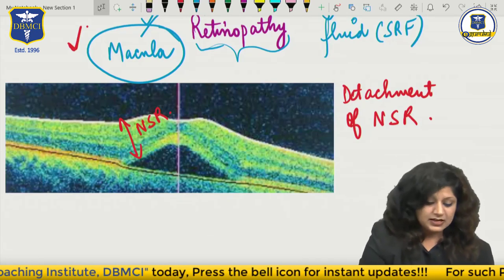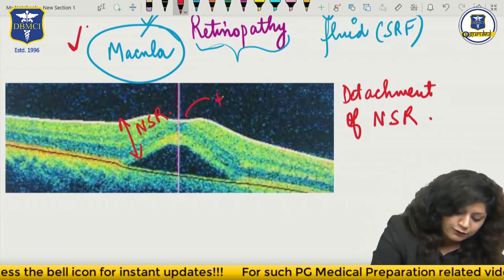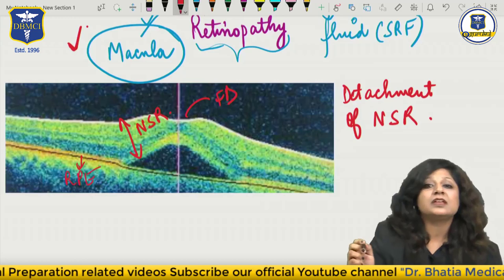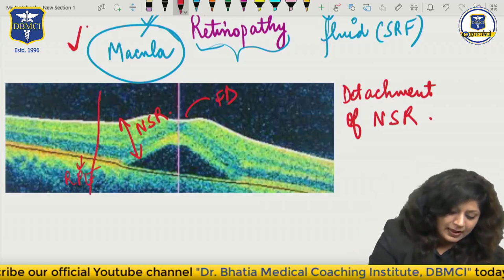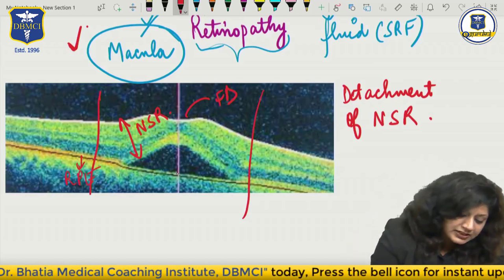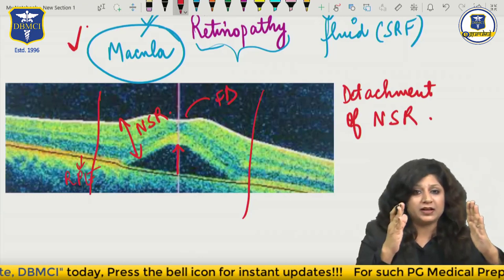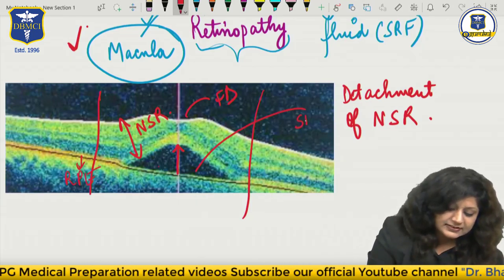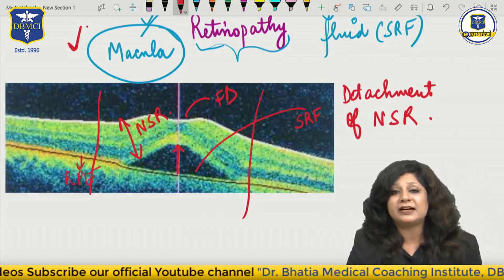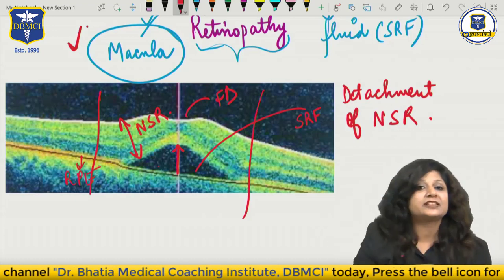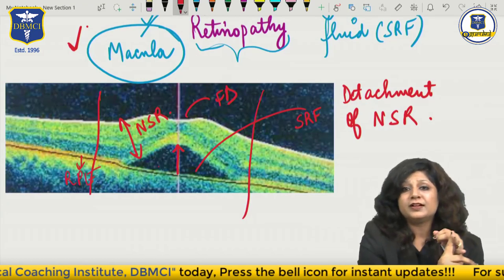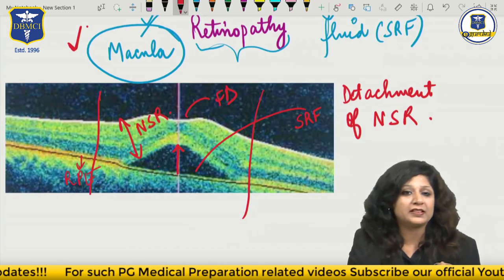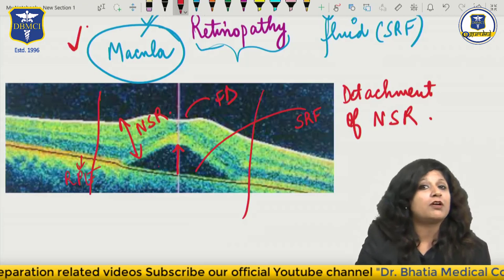Now try to see this OCT. Can you see here - this was the neurosensory retina, this is the foveal depression, and this is your RPE layer - the retinal pigment epithelium. This will be your macular area. Can you see detachment of the macula in the macular area? Because there is detachment of the macula in this area, there is collection of fluid - SRF, that is subretinal fluid. So I can see detachment of neurosensory retina and collection of the fluid. Therefore I can say this is central serous retinopathy. This is how you will see the OCT picture of CSR.